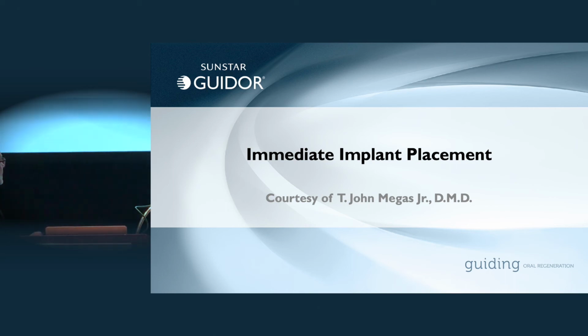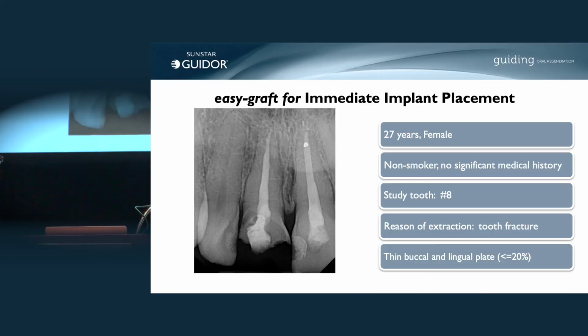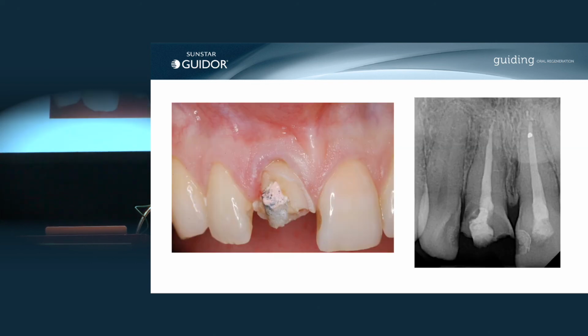In Massachusetts, and he was kind enough to send me one of his cases that I think looked very similar to what you did. Again, this is a 27-year-old female, non-smoker, no significant medical history. The tooth is number 8. It was fractured and had a thin buccal lingual plate and about 20% loss of the buccal plate. Here's the tooth in the radiograph.